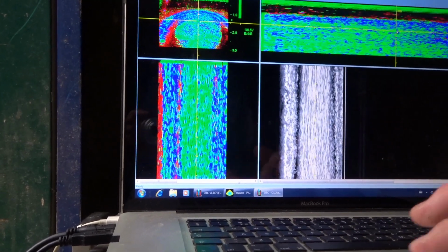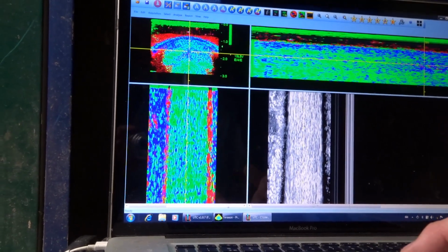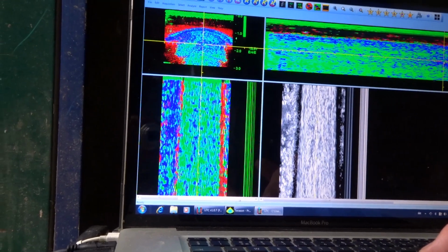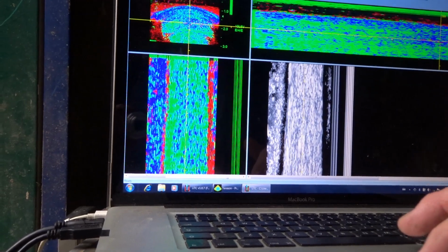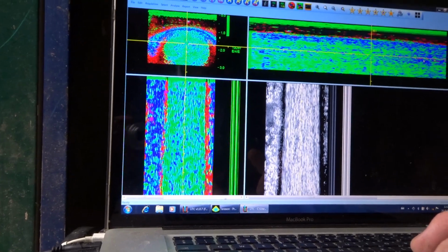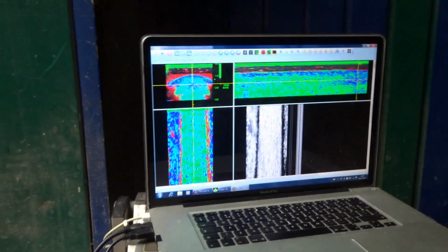The problem is that if I go further down to this area, we see the blue area with red dots. That means there's fiber separation. So this area hasn't been able to withstand the loading that it was given. Whatever loading that is, I can see that the tendon is damaged there beyond, let's say, adaptation. And now we have to decide how we're going to deal with this situation. Okay, that's super interesting.